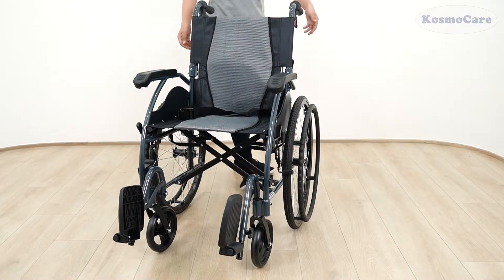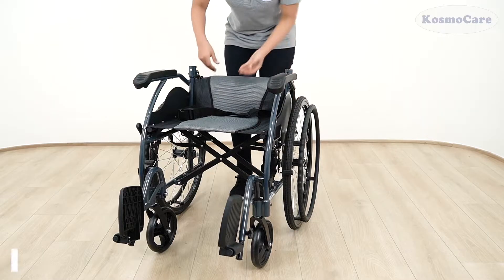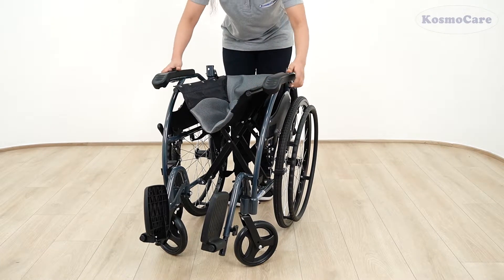Folding the chair for transportation or storage is a breeze. Simply pull both the drop back levers simultaneously to fold down the back support, then pull the seat up to collapse the frame, and flip up the footrest to fold the wheelchair.